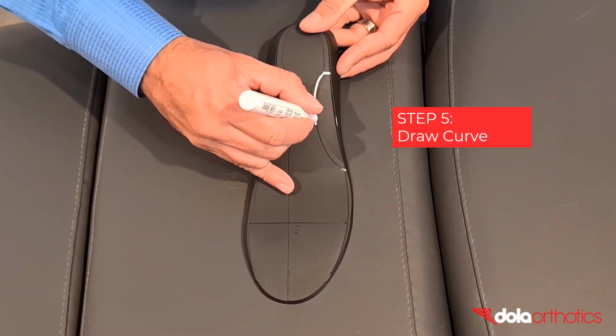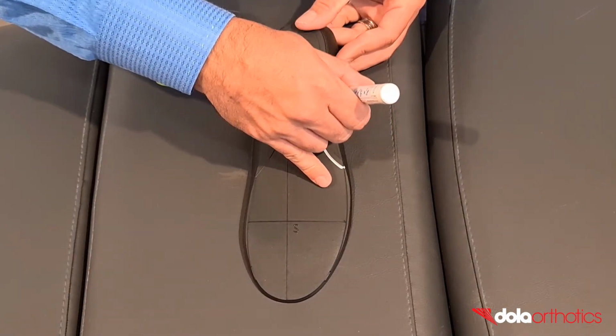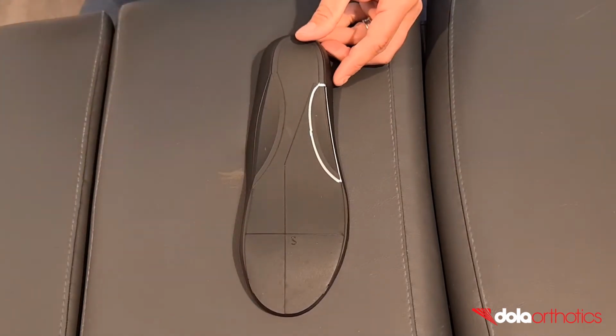Step 5. Connect the lateral and plantar center points to the distal and proximal points in a smooth curve. You now have your lateral plantar grind area marked and guidelines for grinding.